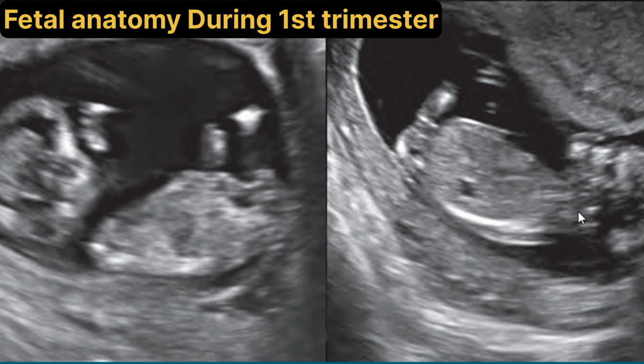Now we are going to discuss the fetal anatomy that is visualized between 11 and 13 weeks. Now here we can see the transabdominal image of the fetus, and here we can see the head of the fetus. Here these are the upper limbs and these are the lower limbs, and here we can see an anechoic structure that is the urinary bladder of the fetus. Now in the sonogram we can see the same structures.